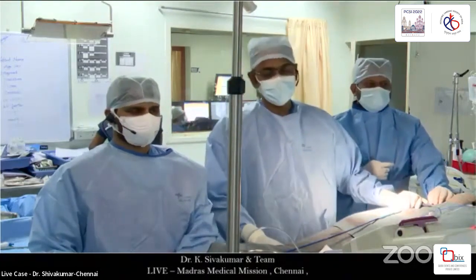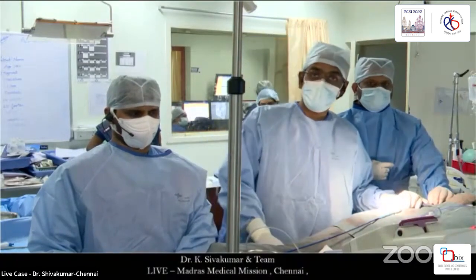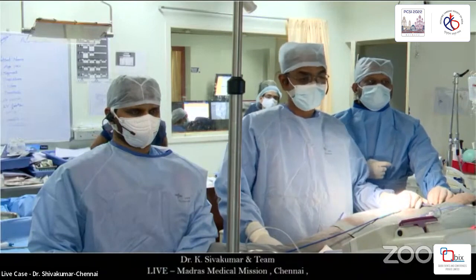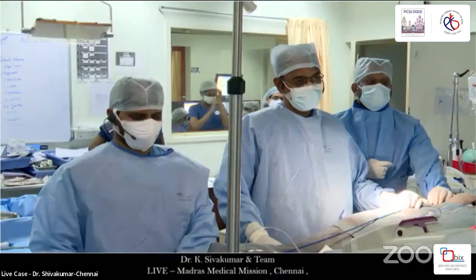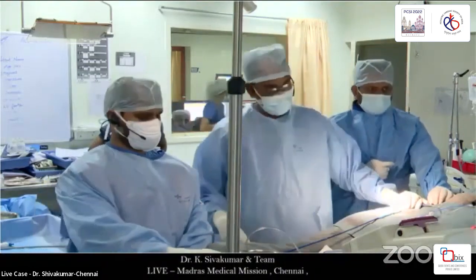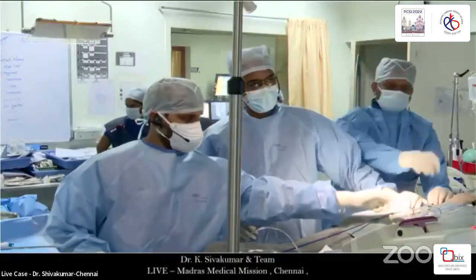So I think we all probably agree that he needs a valve. Is there any question about the indication, Dr. Bharat? I don't think so. I think everybody agrees. Anybody in the audience has a disagreement? I think both by virtue of his symptomatic status as well as his objective criteria.